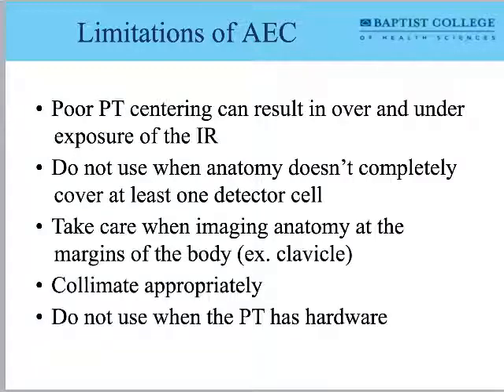So the anatomy needs to completely cover at least one detector cell. The anatomy of interest needs to completely cover at least one detector cell.